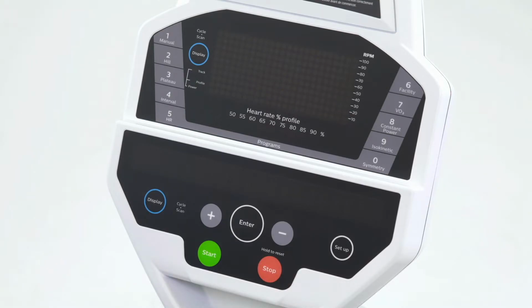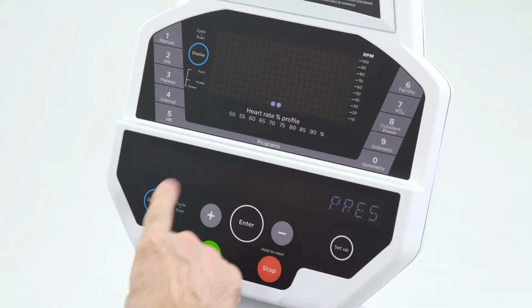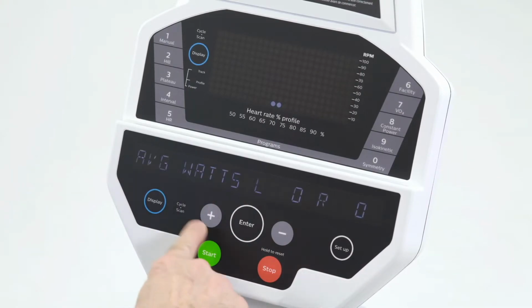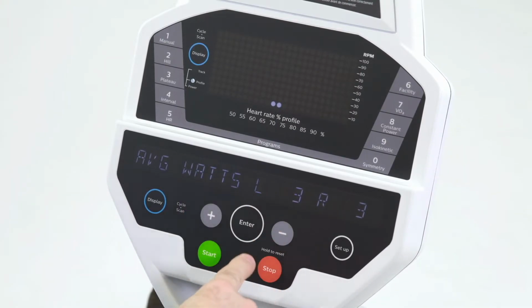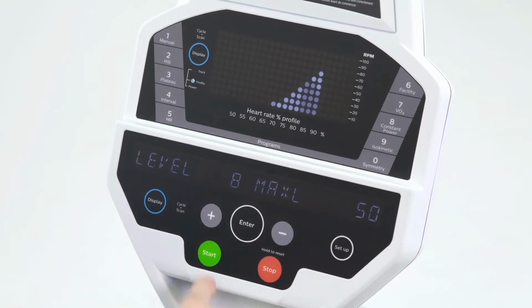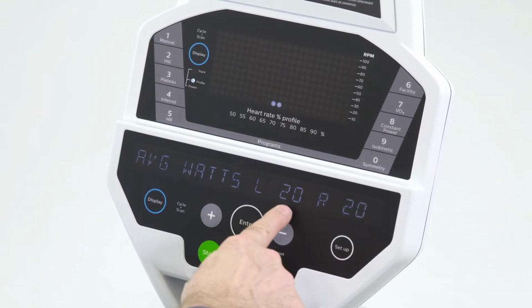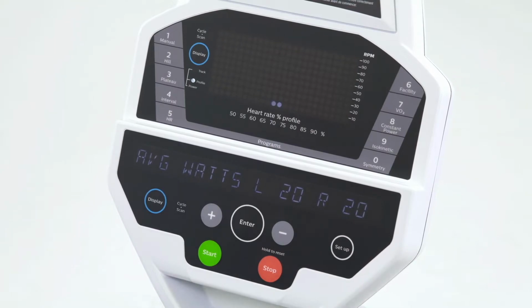In the console, we also have a Symmetry Program. So when I press the Symmetry Program, again, the brake should be off in this program. We're going to be able to measure the patient's left versus right watts. And usually you have to have some resistance on the pedal. So now as I'm pedaling and I'm symmetrical, I'm getting watts of left and right 20.